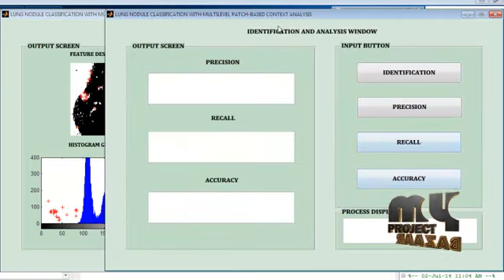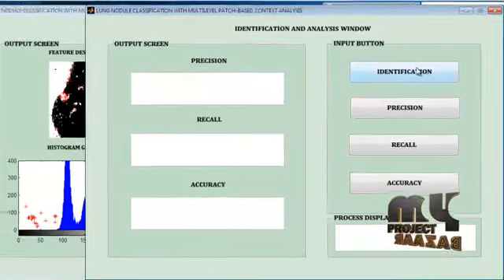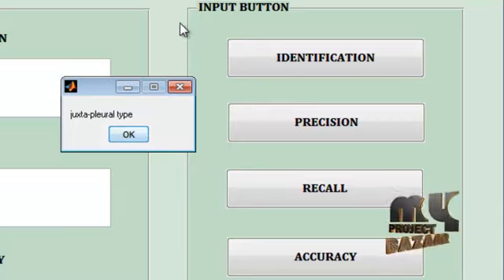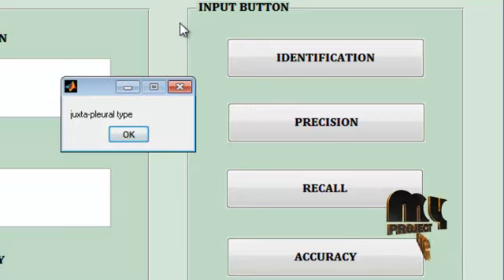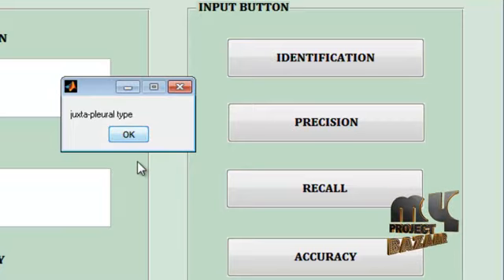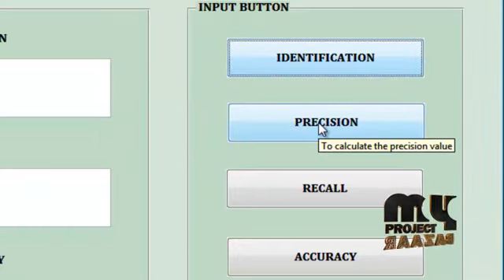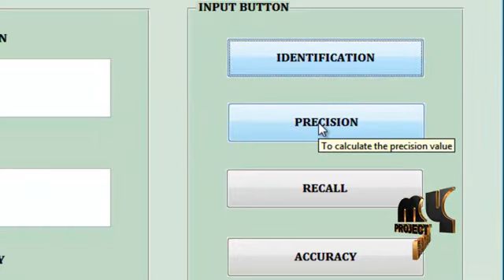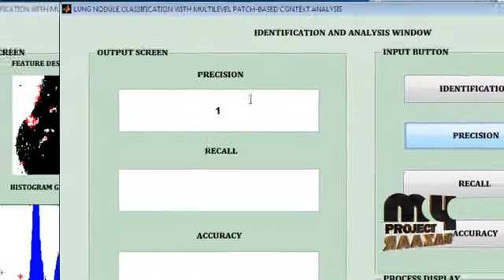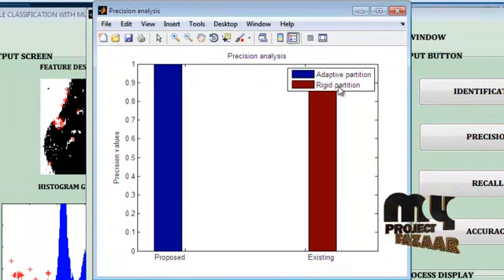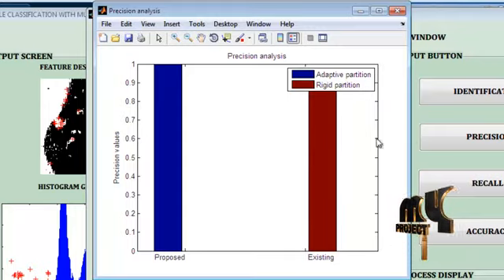Then go to the identification analysis process, which classifies which type of lung nodule is identified. The lung nodal type identified is the juxtapleural type. The precision value is 1, and the graph for precision comparing the adaptive partitioning and rigid partitioning methods is displayed.